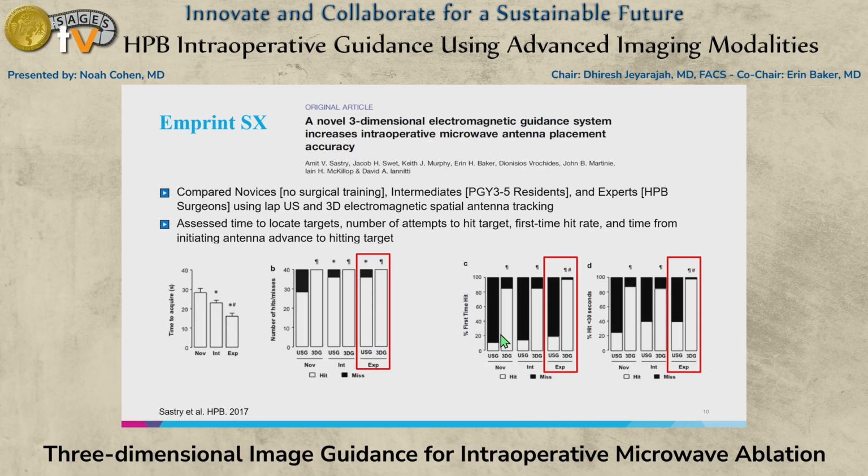So again, thanks to Dr. Baker, who was a co-author on this paper. And what they did in this paper was they had a lap ultrasound trainer, and they compared typical laparoscopic ultrasound to 3D image guidance ultrasound. And they looked at novices, senior residents, and experts, so HPB surgeons, and they were just looking at any differences between usual lap ultrasound and 3D guidance.